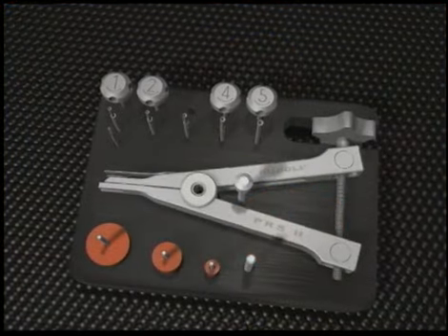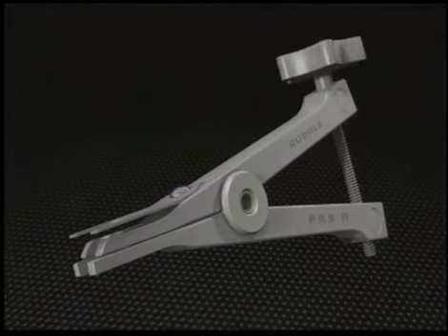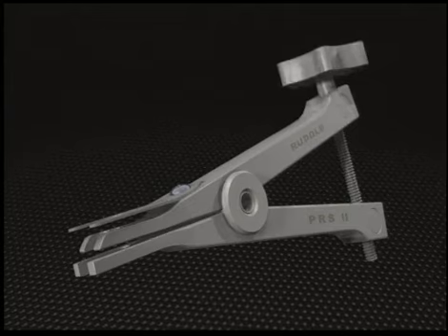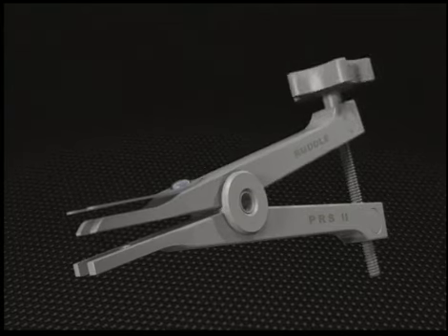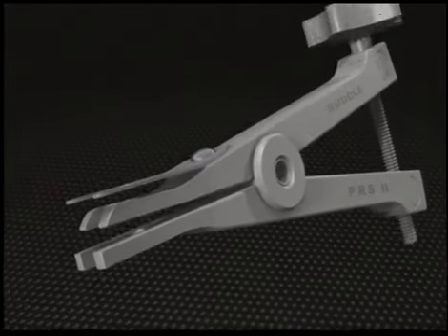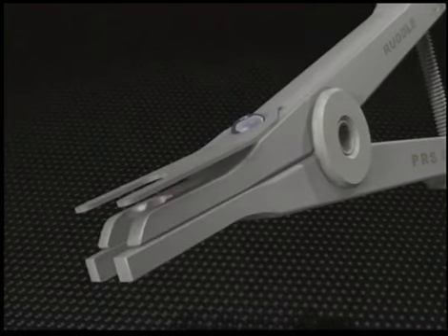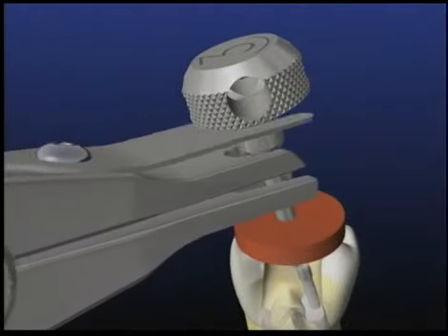Now select the extracting plier from the PRS kit. The screw knob is turned clockwise to activate and open the arms of the plier. This simple action efficiently and safely generates the removal force. The plier's small profile allows for easy access to posterior teeth. Properly mount the extracting plier on the engaged tap.